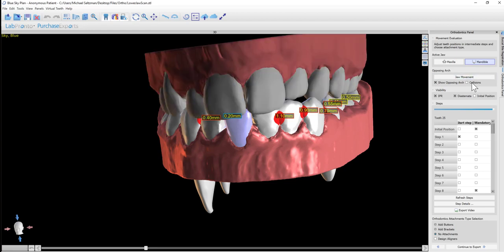We could activate the visibility of collisions, IPR, the spacing between the teeth, and we could also click initial position to bring up the initial model positioning.